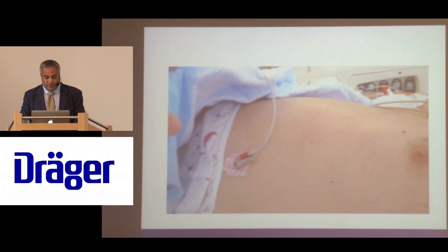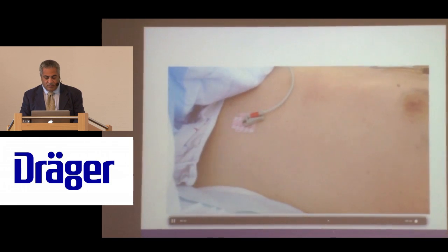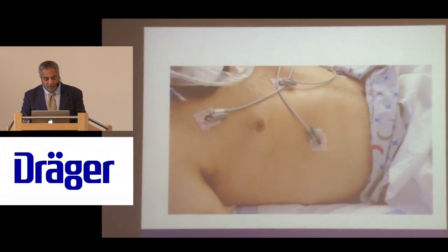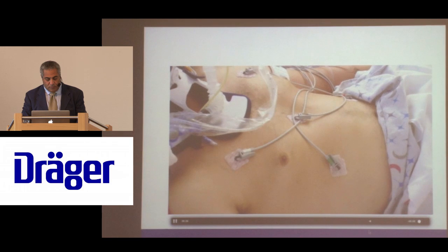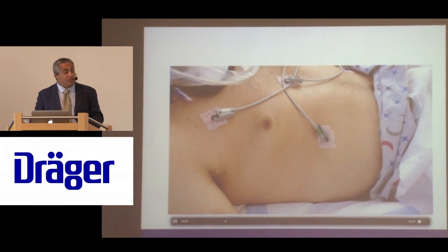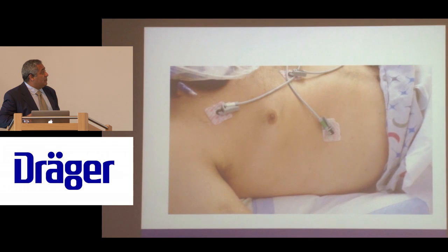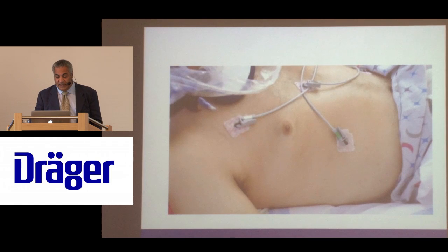Let me see if this is the patient. I think this might be the patient here. Okay, so let's look at this patient. Now this patient, you can see he's doing a little bit more effort than probably what we like.